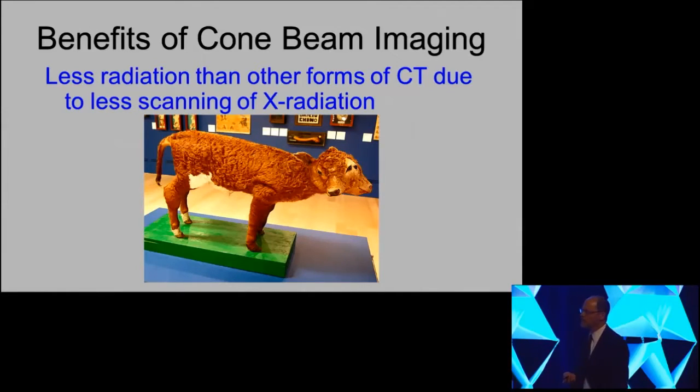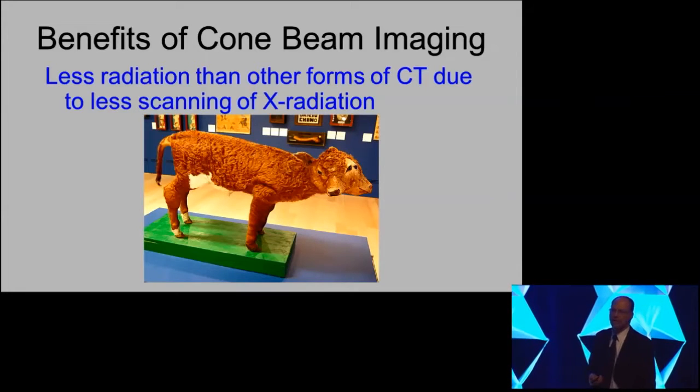Now, the systems that are currently used in medicine, the detectors and the scanners and the software, are much more powerful in terms of their contrast resolution ability. So we really evaluate structures primarily in the calcified densities, and it gives us very good contrast resolution of bone, but as far as the contrast resolution of soft tissue, it's very poor. It's not designed to do that.